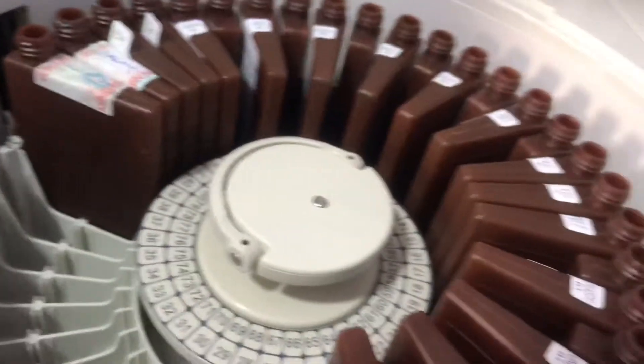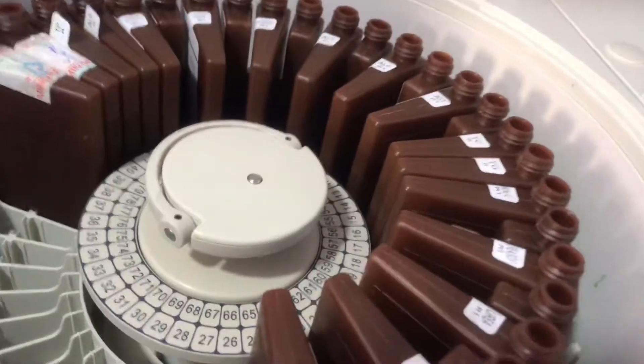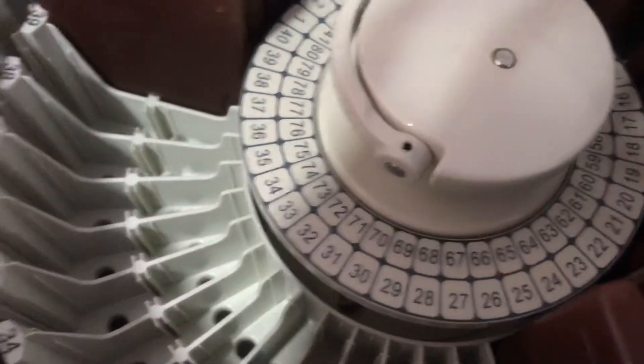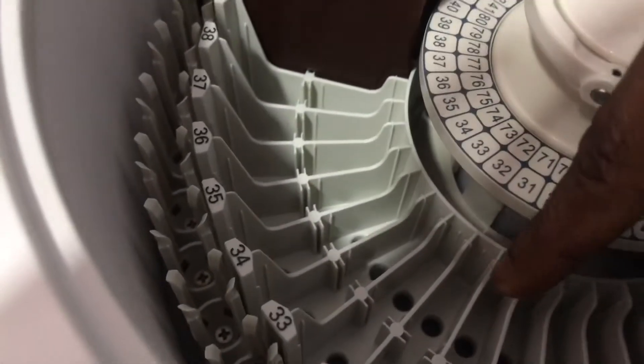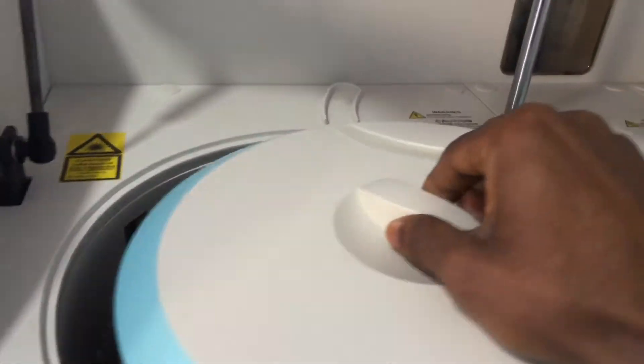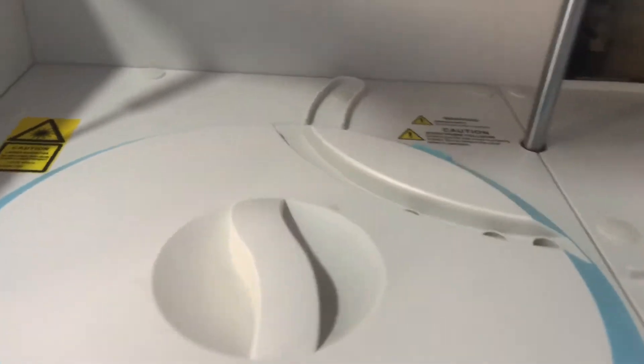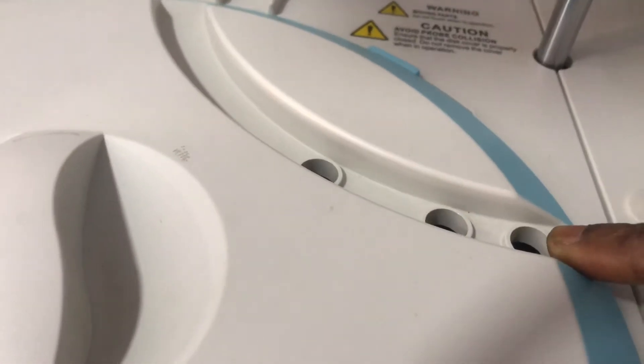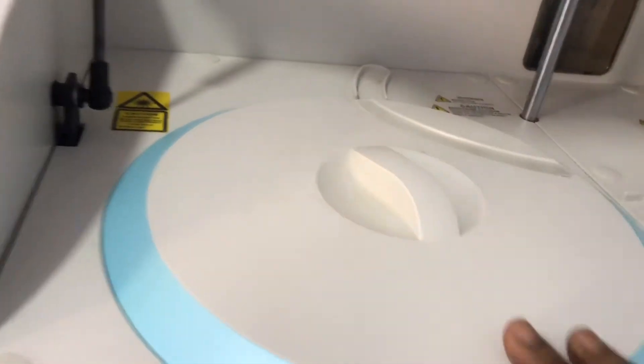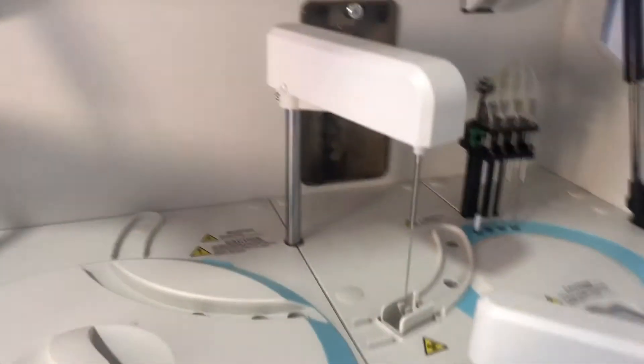And then we have the middle ring which holds the reagents, and then we have an inner ring. When you quickly close it with a cover, you realize there's a hole here—this is the outer ring, this is the middle ring, and this one will be the inner ring.